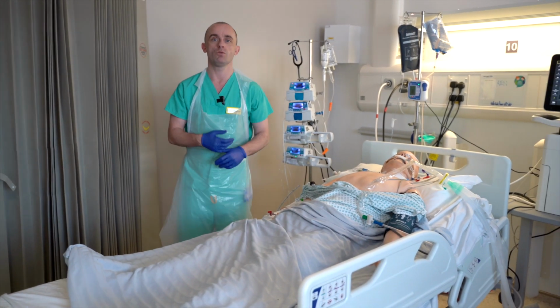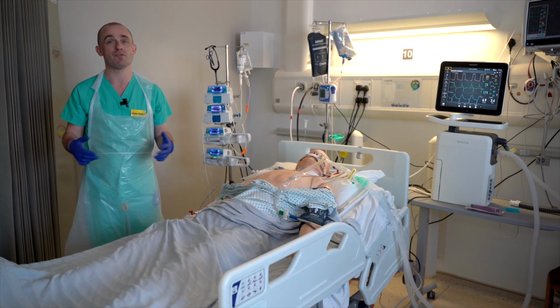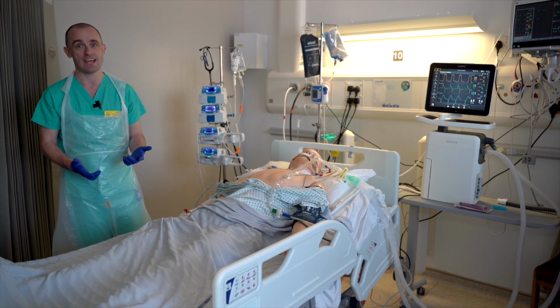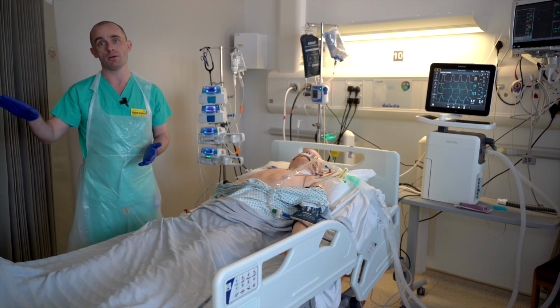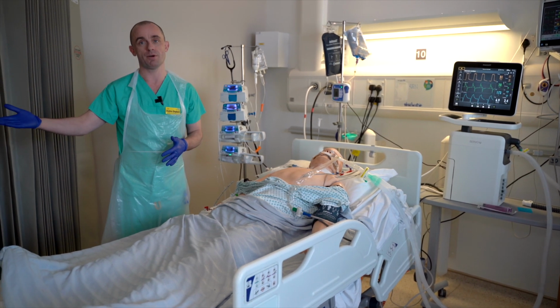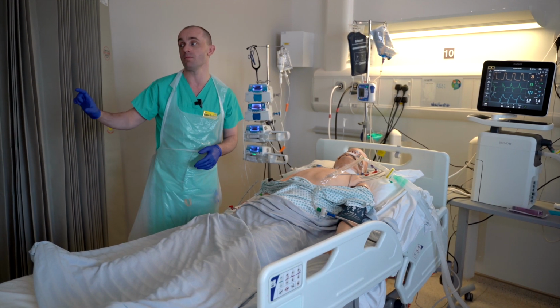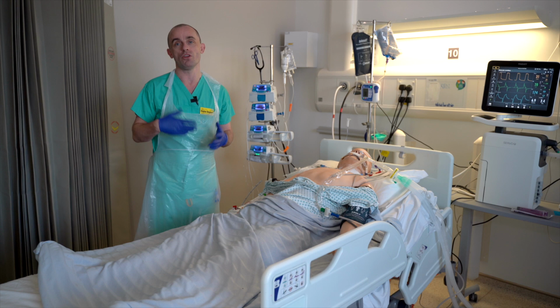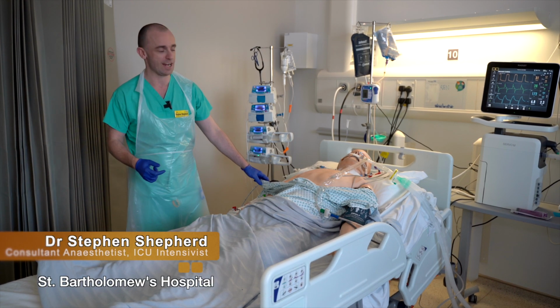Okay, so again, we are going to provide you with information about what the expected dose ranges are for many of the drugs that we use in intensive care, but we can be reassured that that level of support isn't going up. And again, if we look at the trends on the blood pressure chart, we can see that actually this patient's blood pressure has been stable over that period. So although his FiO2 has gone up, his degree of cardiovascular support hasn't changed.